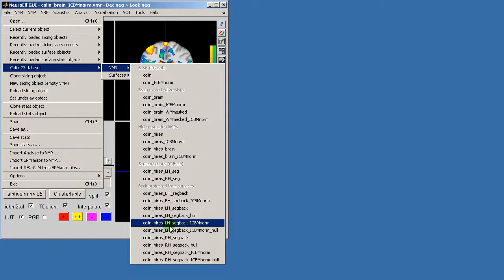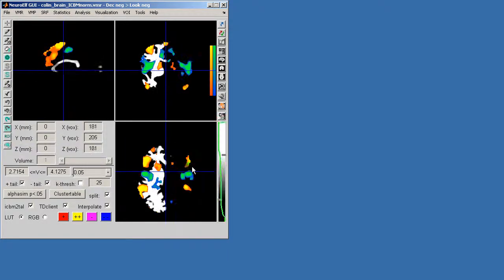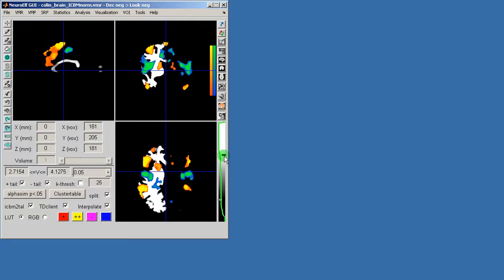And to get a more well defined outer kind of surface I increase the contrast of the file now so that I can then easily show a very well defined surface.